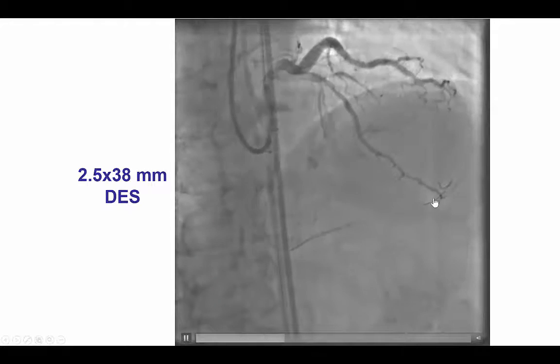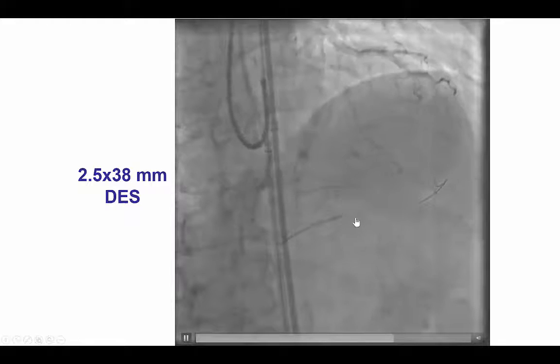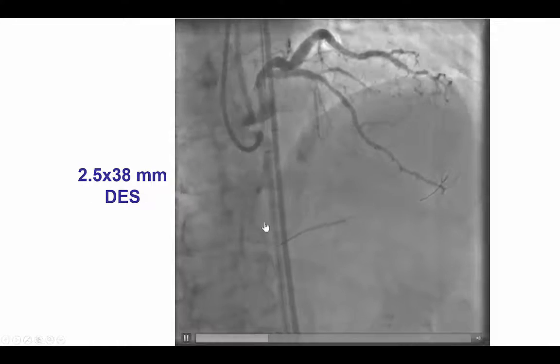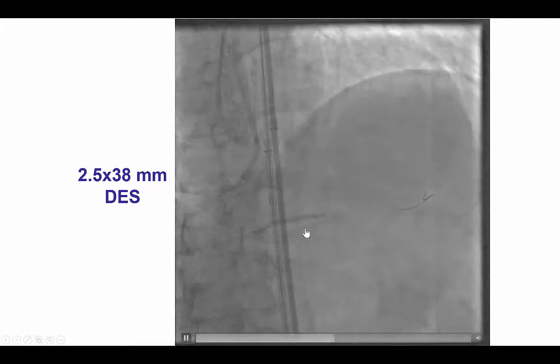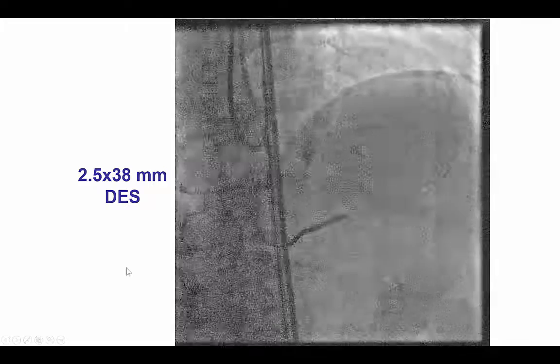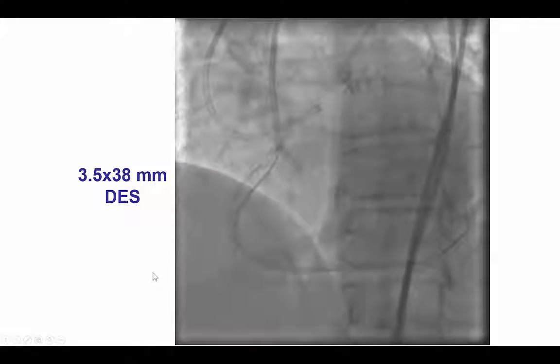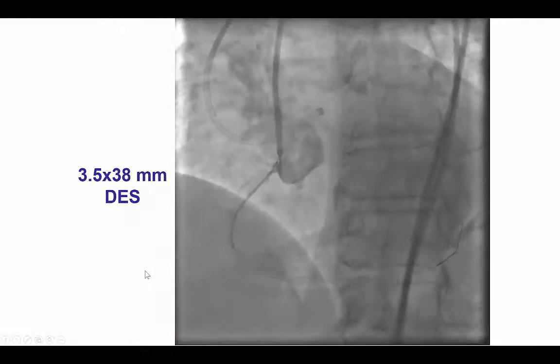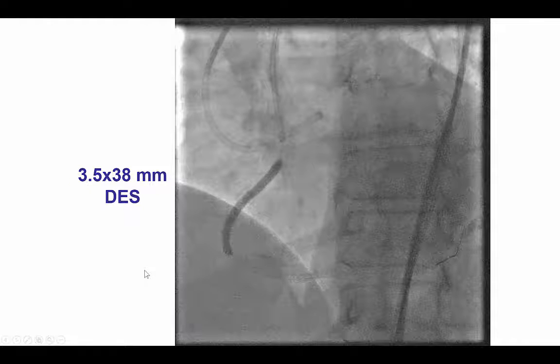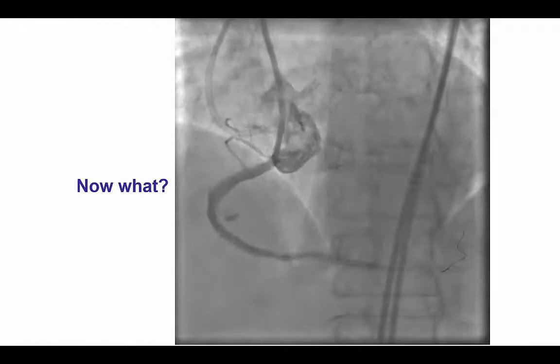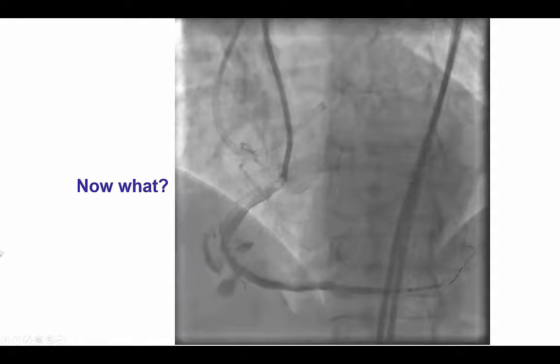We exchanged the guidewire for a workhorse guidewire and then placed three drug-eluting stents: 2.5 mm, then a 3.0 by 38 mm, and then a 3.5 by 38 mm, all the way to the ostium of the right coronary artery. However, after deployment, this is what we found.